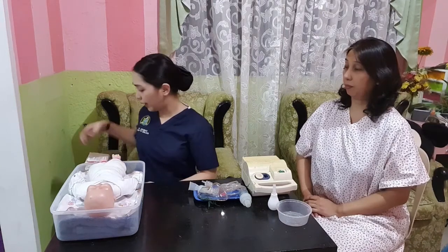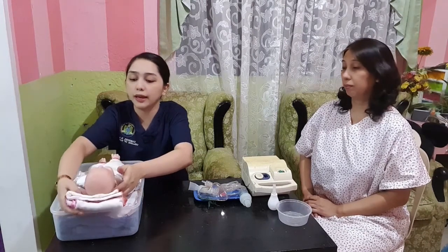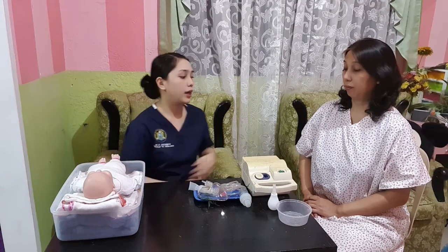Next is to place the patient in a comfortable position or sitting up in a chair if able, or semi-Fowler's position. So this improves lung expansion and medication distribution. So for the infant, I can put pillow underneath the head, or also I can carry and bring the infant to the mother for proper positioning. And here my patient, I have already placed her in a sitting position.